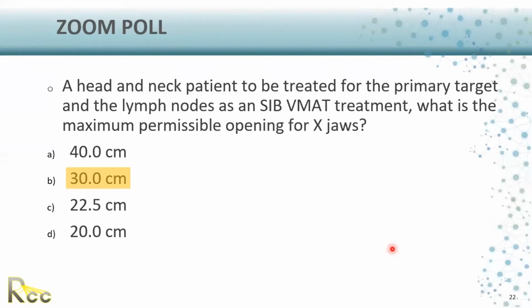Okay, so I finished part 2, and I now leave the door open for any questions for part 2 before we go to the live discussion about the submitted plan. If there are any questions, I'm happy to answer. I think the only questions still correspond to masks and couches being included when you're calculating the plan and how those are included. We already went over the mask, but if you want to touch on couch inclusion, that would be great. Okay, so why do we include the couch itself?